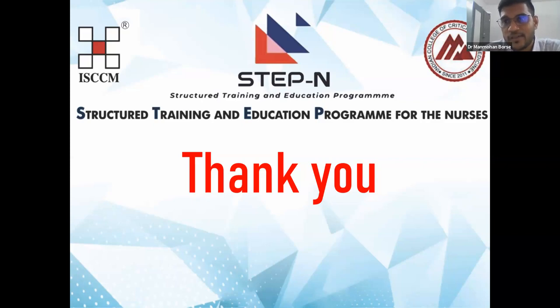Like ABG, there are so many talks already conducted on ABG, but on TEG, I think very few talks have been conducted, and TEG is the upcoming thing for coagulation. That's why today we covered TEG particularly: how to do TEG, how to interpret your TEG reports, and most importantly, what products to give the patients. Unnecessarily, haphazardly, you are giving FFP, cryoprecipitate, platelets. By doing TEG, you can identify what the requirement of the patient is, what we have to give the patient now. That's why we discussed TEG today.